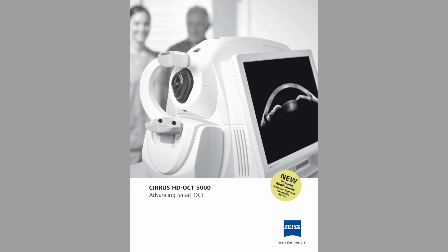I mean, you look at Cirrus with fast track eye scanning, or it can watch out for your blinks, things like that. So, Paul, I think a lot of the time in the old days, these things would take a long time because you'd have to just do it over and over and over again. But being able to position the patient consistently, being able to have the computer actually look out for you and say, oh, this person's blinking, this makes a huge difference.